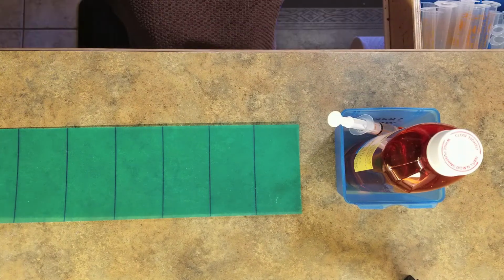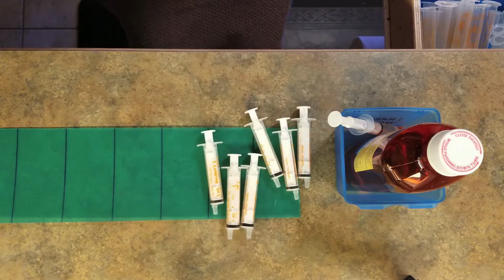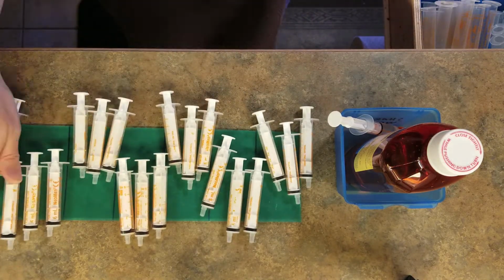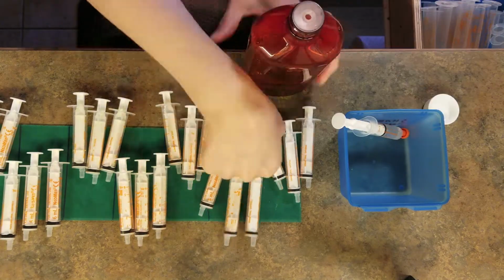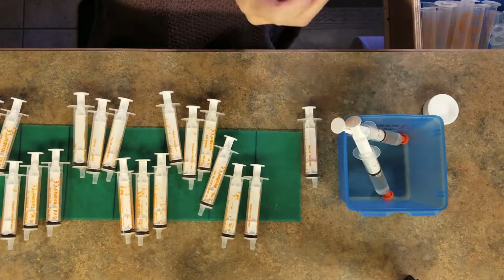I created this little green chart for 7 days. I try to prep meds once a week if I have time. The med that I'm drawing now uses 3 syringes a day, so it's just an easy way to draw meds without counting 7 days worth of syringes.